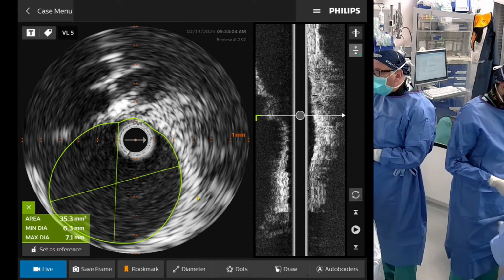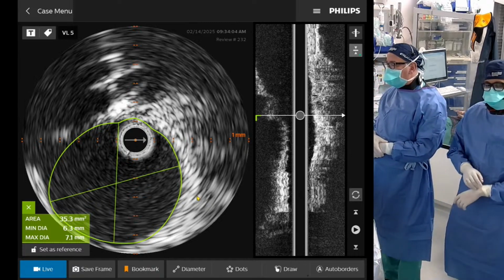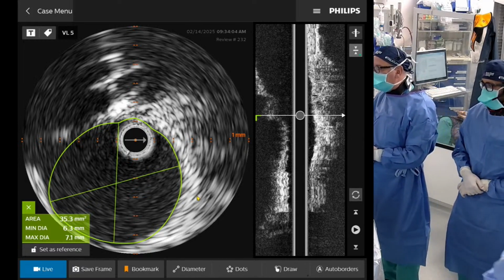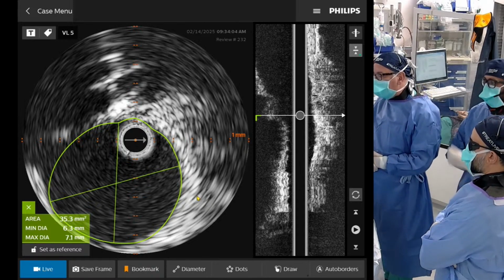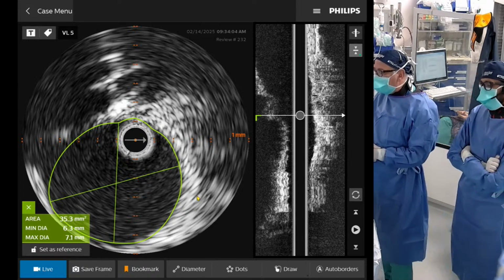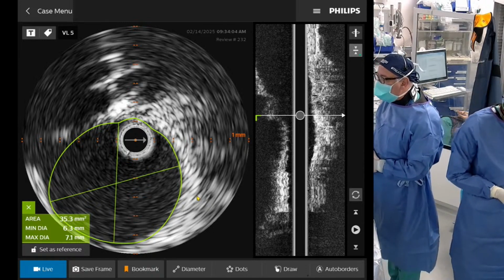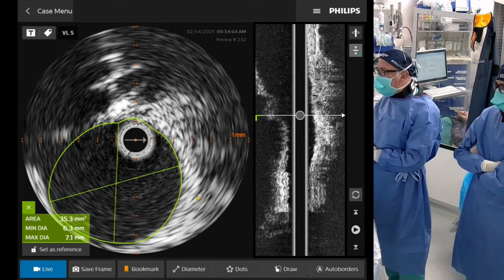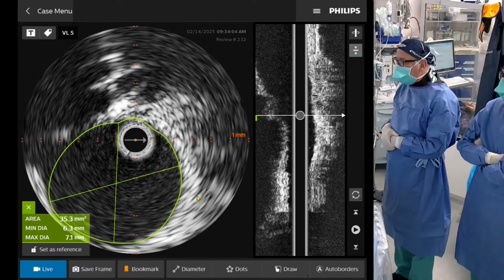From what I've been told, you can take a 5 mm polymer-based drug-eluting stent up to about 5.7, 5.8. You really can't take it up to 6 without starting to get polymer breakdown. That's the transition point, and it depends on the manufacturer whether you'll have significant or just moderate polymer breakdown. Some will say it can handle up to 6, but in my experience, if you're over 6, it's probably not a good idea to put a drug-eluting stent in.